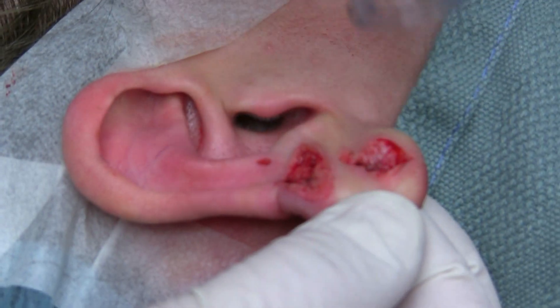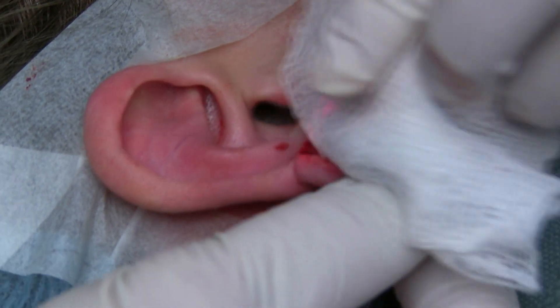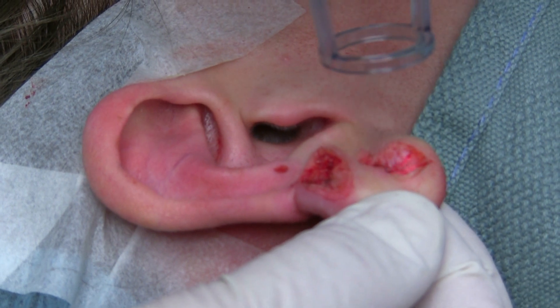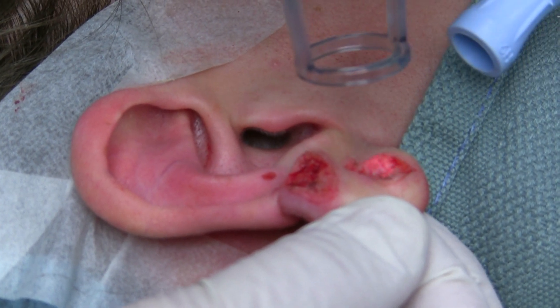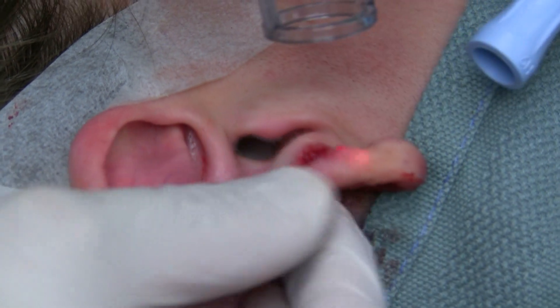So we're going to use the DeepFX laser. We're at 25 joules per centimeter squared and we're going to hit the base of these keloids. This is deep ablative fractional resurfacing.